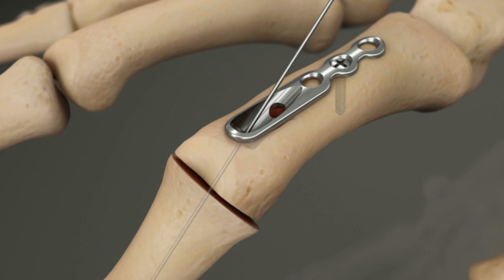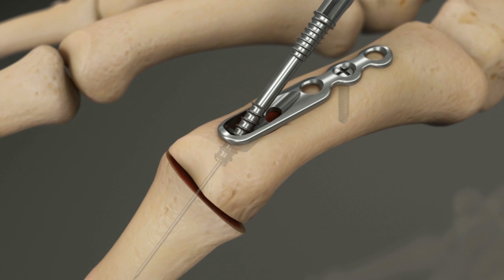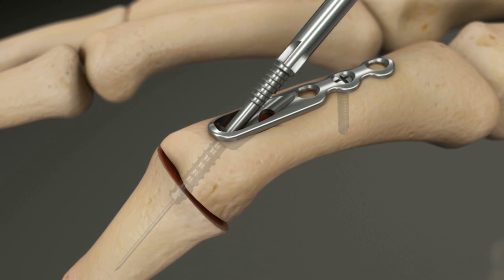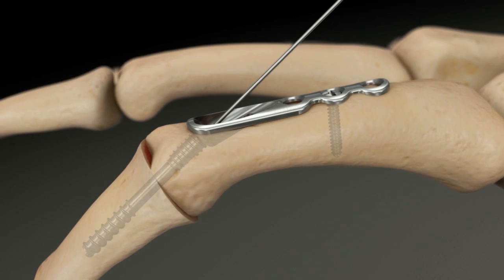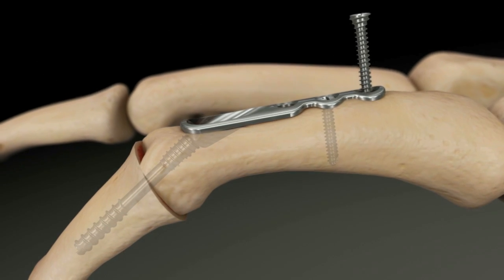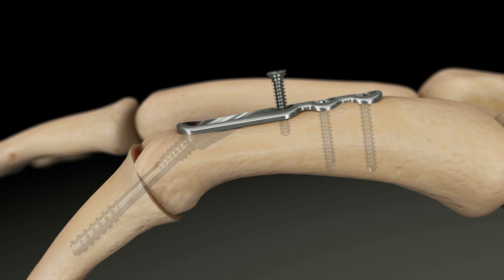Reduce the joint before inserting the screw to ensure maximum compression. Firmly hold the distal bone when locking the screw to prevent mal-rotation. Fill remaining screw holes with solid core screws from HPS.